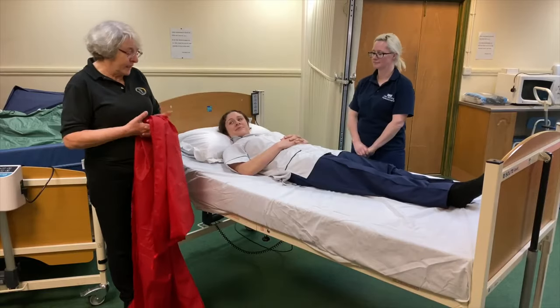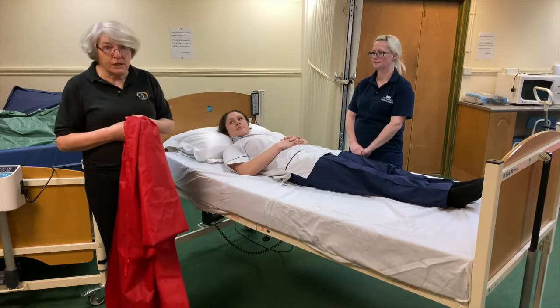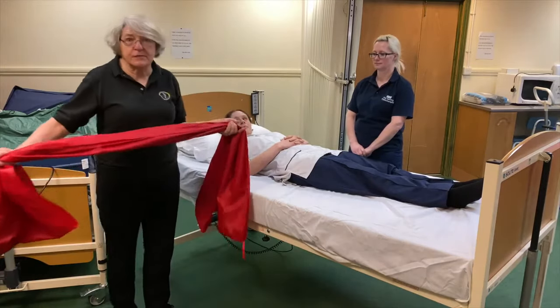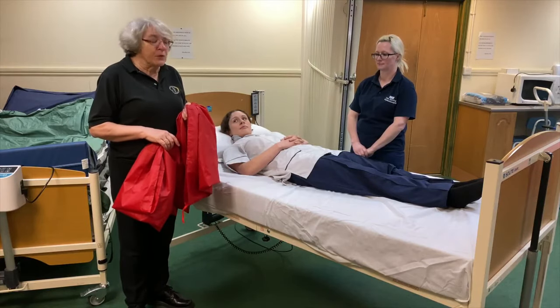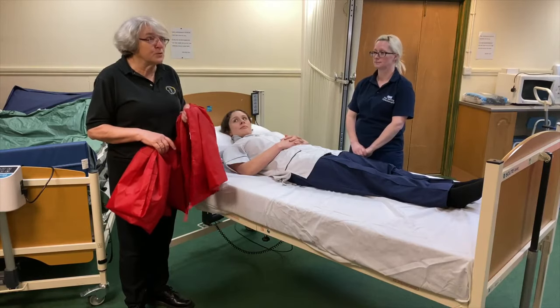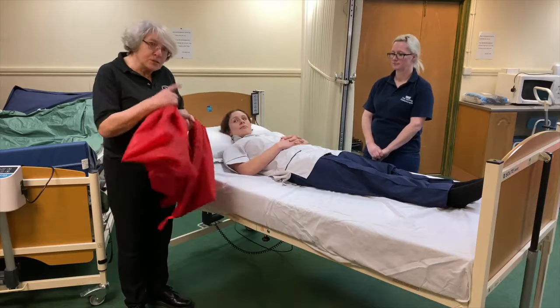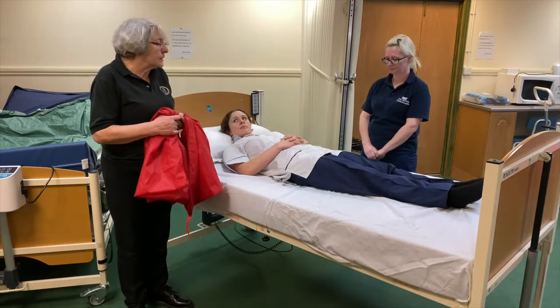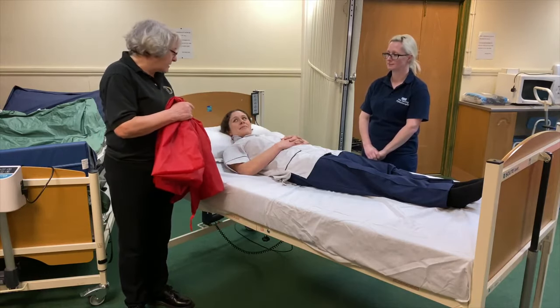Okay, now we come on to slide sheets. Slide, slip or glide, whatever word you use, it doesn't really matter, but slide sheets I think is one of the most common words that we use now. We have had these for a long time now, getting on for about 25-30 years. As you saw when we rolled Alice, she was on the side of the bed, which is a little bit scary.